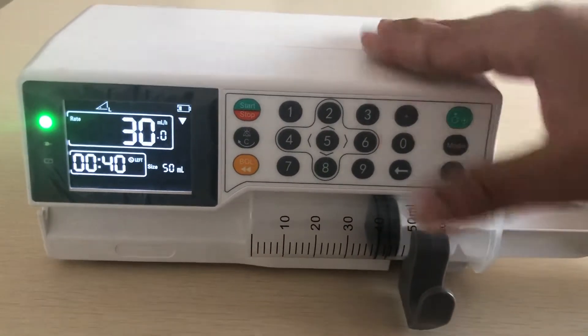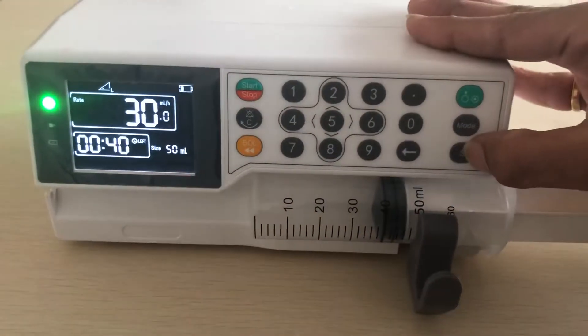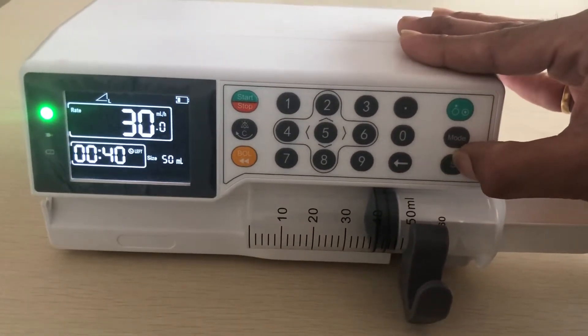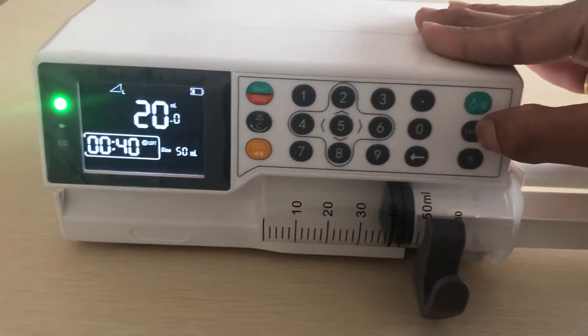If I want to change the mode, then you can stop here, then — sorry — mode. This is volume.